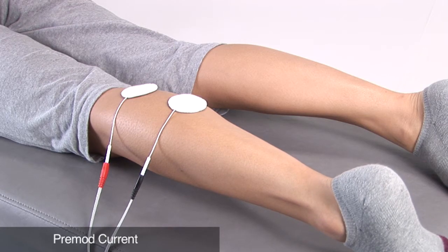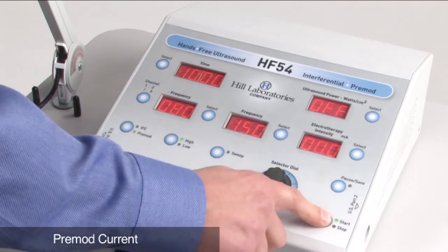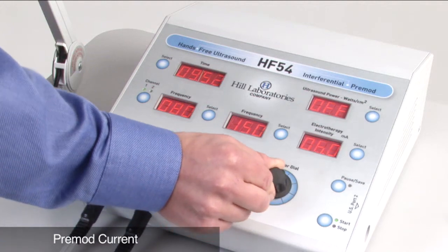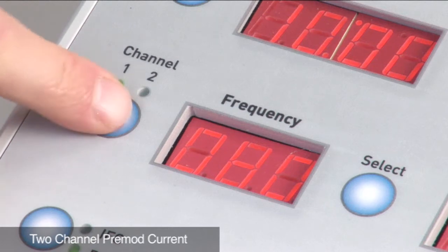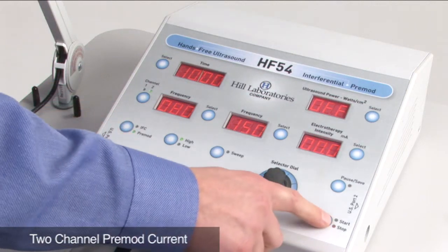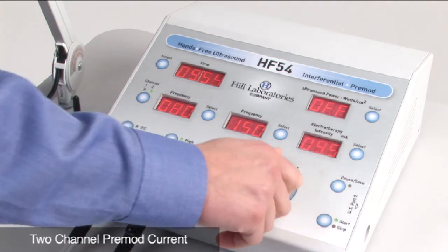For a two-pad application for smaller areas, select the pre-mod button and press start. Adjust the electrotherapy intensity to your patient's comfort. Stimulation through the second channel can be performed in pre-mod mode. Select channel two, then assign pre-mod to that channel. Set your electrotherapy intensity for channel two, then change to channel one and set the intensity.